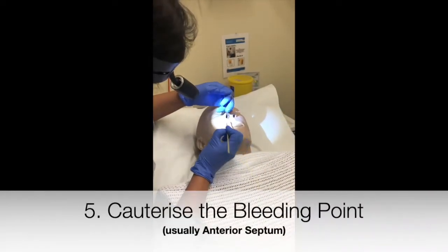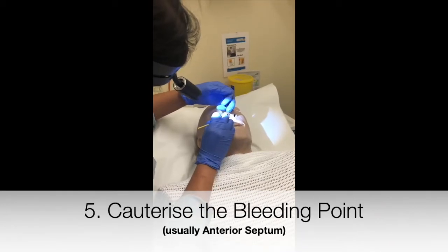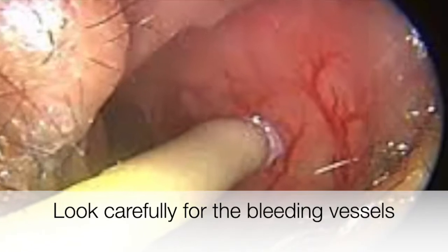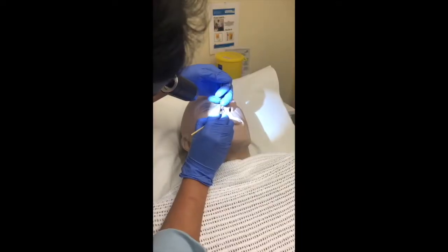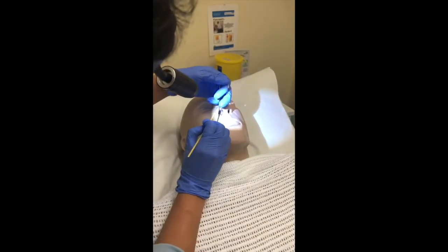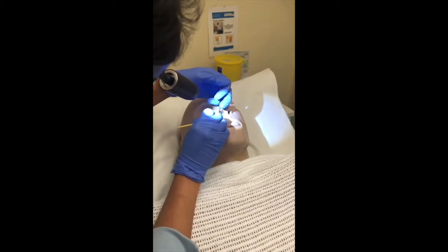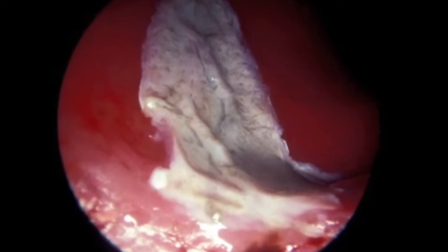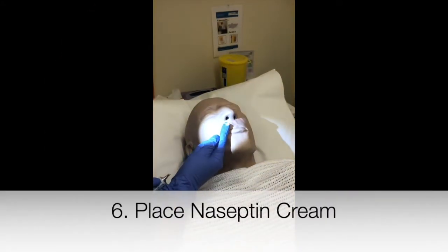Cauterize the bleeding point, which is usually located on the anterior septum in Little's area. Look carefully for any bleeding vessels. Cauterizing the septum normally turns it white. Then place Naseptin cream into the nose.